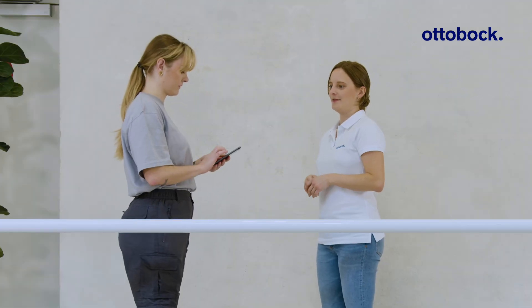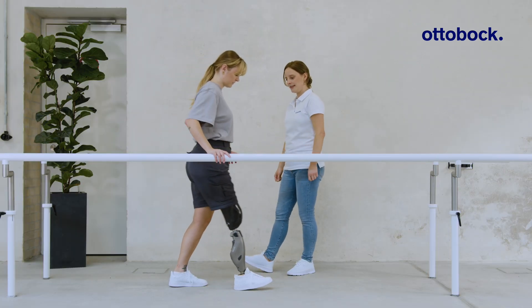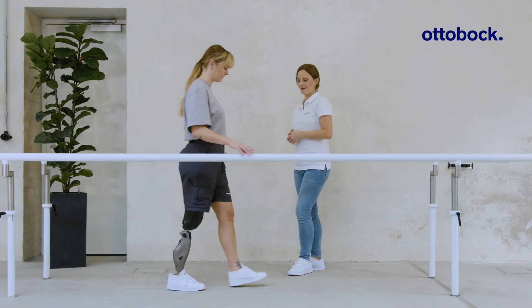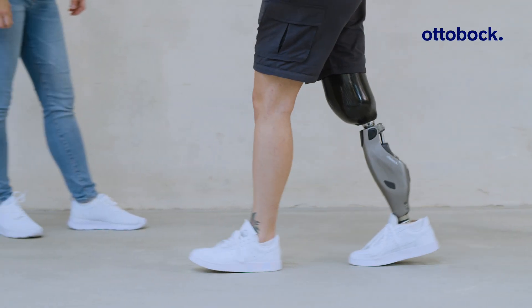Training with a locked stance phase can be helpful for users who are starting gait training. As the user has achieved sufficient stability, unlock stance phase and continue training with stance flexion.